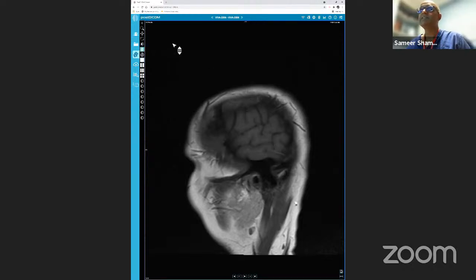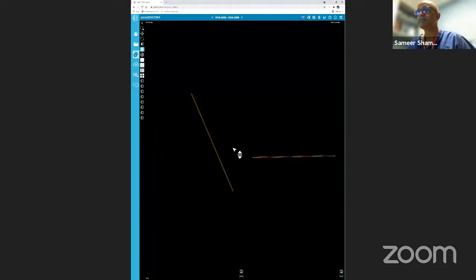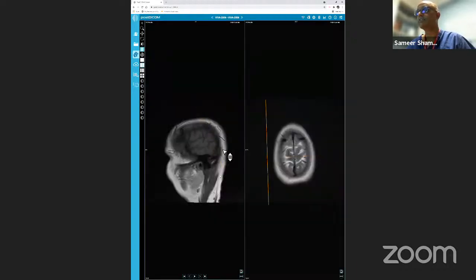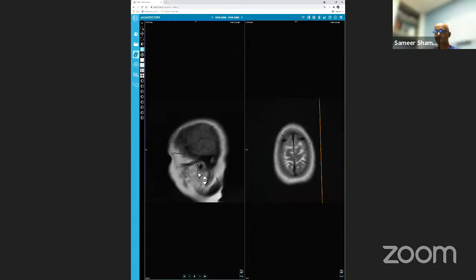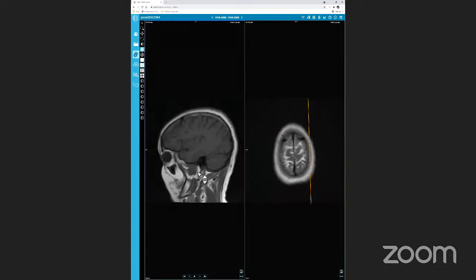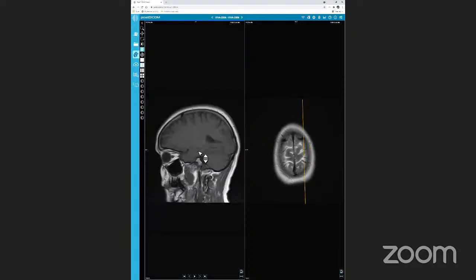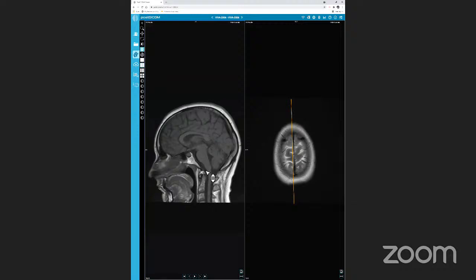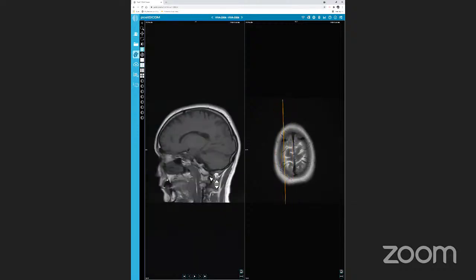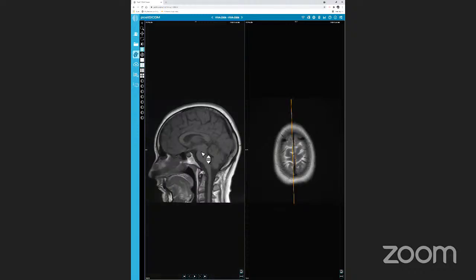So this patient presented with epilepsy. Okay. So I want to give you two sequences, so that's just the standard sagittal T1 and the T2 weighted sequence. So feel free to scroll through. So click on the image and then scroll. So on the left, we have a classical T1 sequence of a patient who has epilepsy. So there are normal midline structures, you can see the pons, the brainstem and the corpus callosum. There's no abnormality there.